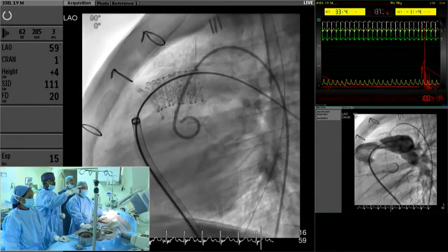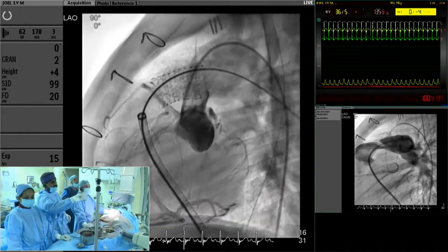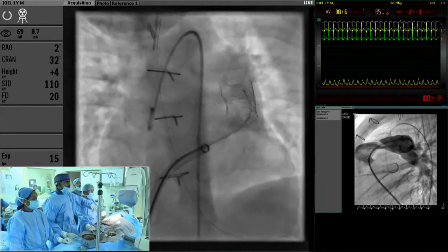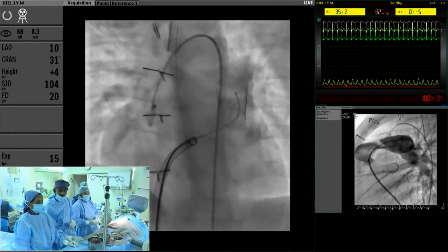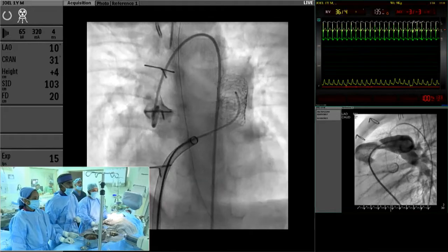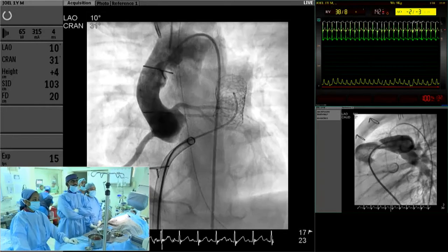Now it was showing very clearly here. In this picture, we can see the whole coronary coming anterior to the pulmonary artery, going posterior and descending as the LAD. Cranial. Yeah. Can we inject? Yeah. Freeze it and show that LAD. Yeah. The second vessel is the LAD.